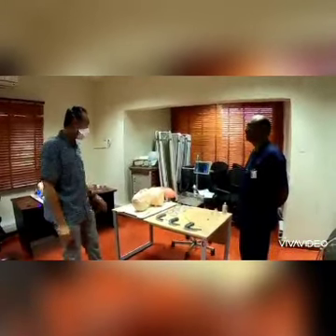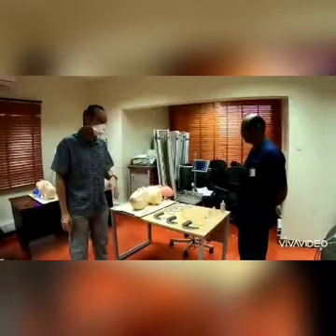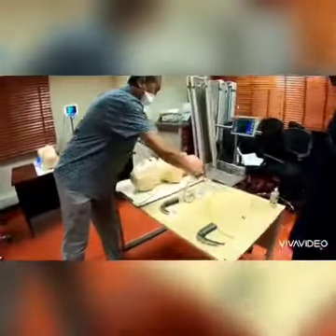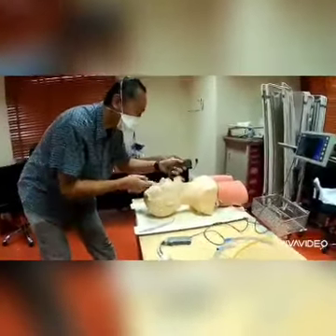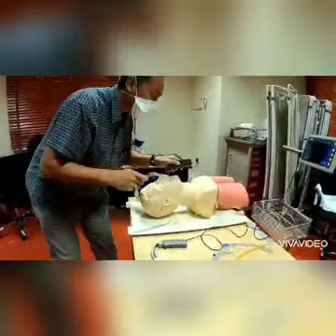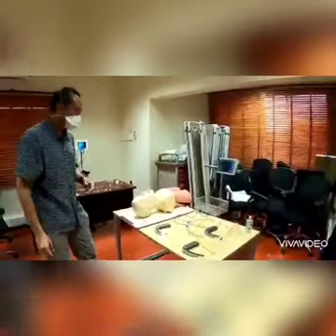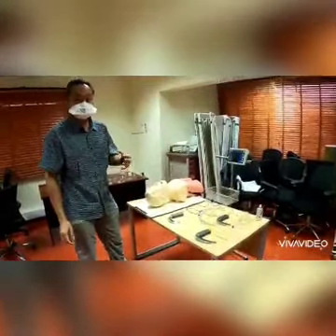Okay, so today we're just going to go through very quickly how we're going to intubate during the COVID-19 era. Normally, most people will intubate with direct laryngoscopy. In other words, you'll be very close to the patient's mouth. You'll have to see the vocal cord, and then you'll have to intubate. But because of the very high risk of droplet spreading and aerosolization, we are encouraging every intubation to be done by video laryngoscopy.